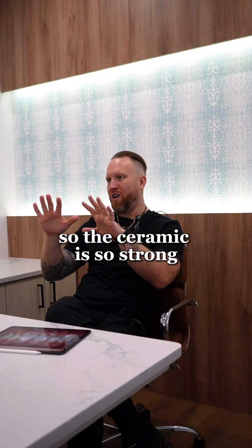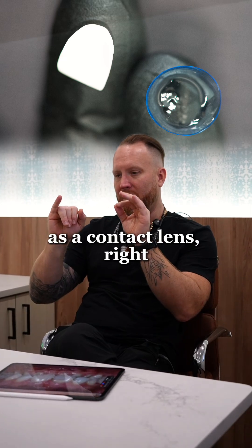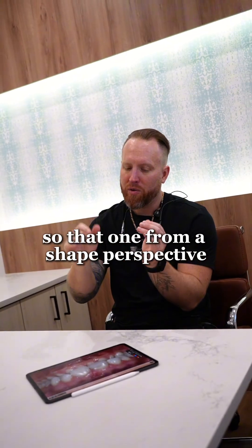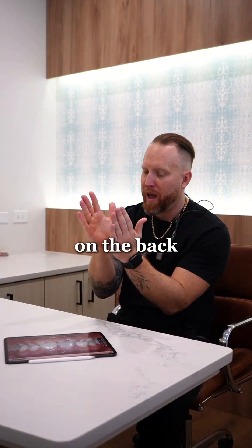The ceramic is so strong that we can literally keep it as thin as a contact lens. Now for this one, it's like half bonding. So we're going to take all the bonding off and then we're going to kind of wrap it over. That one from a shape perspective might be a little bit more of a crown because there will be some ceramic on the back.